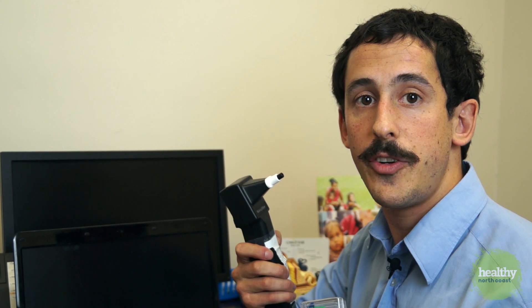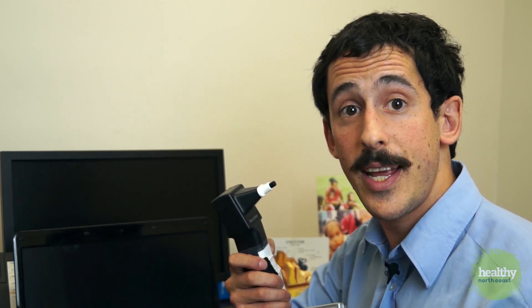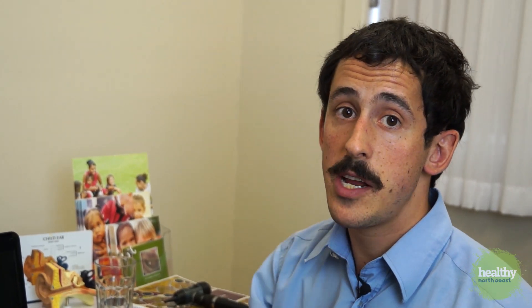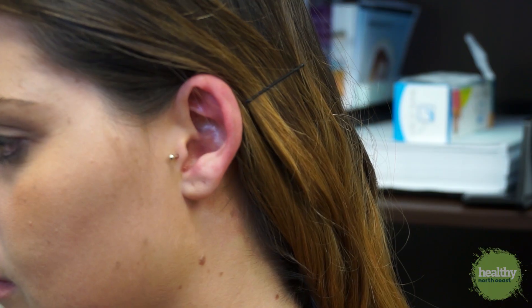If you're having trouble deciding whether an eardrum is mobile or not, you can shore up your hunch with a tympanometer. The tympanometer is a very simple tool which uses a variety of tips inserted in the ear to measure directly how mobile the drum is. You can tell patients that the tympanometer will feel funny in their ears but it definitely won't hurt. Most tympanometers come with three or four different size tips — you'll know you have the right tip because you get an accurate test result. If your tip is too small you will get an air leak.